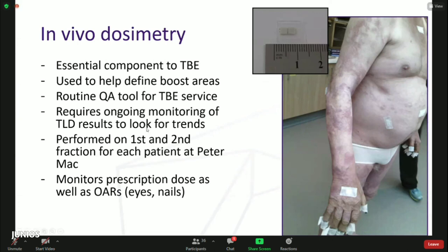And here in this example, you can actually see the patient has these bits of tape on the end of his fingernails. These are actually lead shields that we have strapped to each of these individual fingernails, because if you don't shield the nail beds, they sometimes fall out, which is a bit of an unpleasant side effect for these patients. So in cases where there's no evidence of disease around the ends of the fingers, we will actually opt to shield the nail beds.